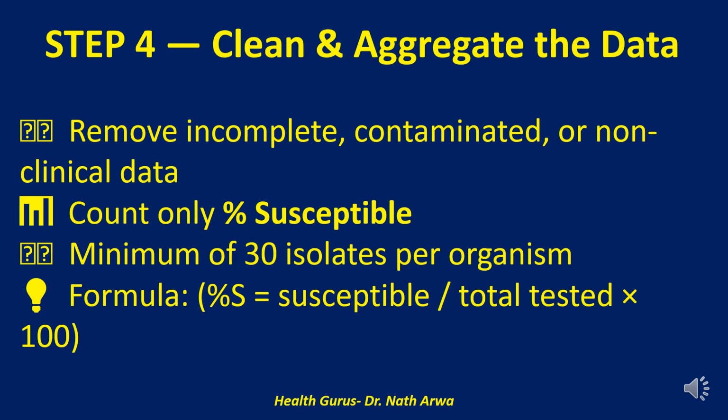Alright, we've collected our raw data. Now comes a critical step that can make or break your antibiogram: cleaning and aggregating your data. Think of this as sanitizing your house before hosting a guest. Only this guest is clinical decision-making.